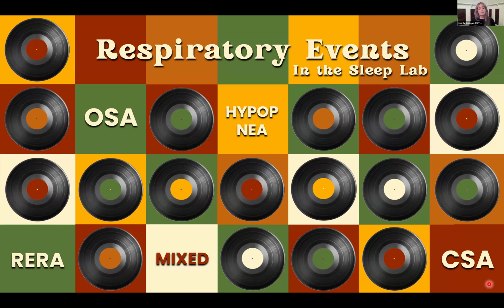So those are arousals that are caused by respiratory events that don't meet the criteria of hypopnea or apnea. So it's an arousal that the patient has, but we don't have that 30% drop in flow to be a hypopnea. And this is reported out as RDI, respiratory disturbance index. It doesn't count typically towards insurance and helping get the diagnosis, but we do score them, and they are an important part of what we monitor.